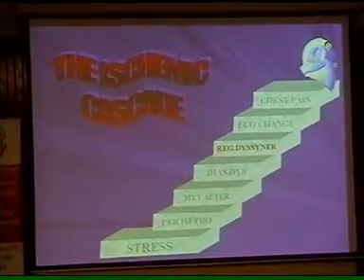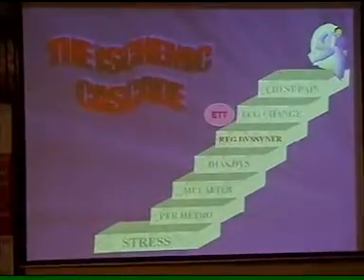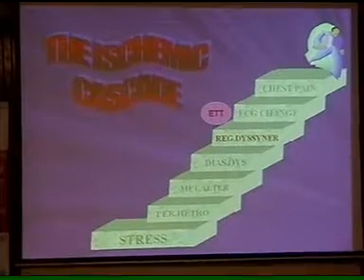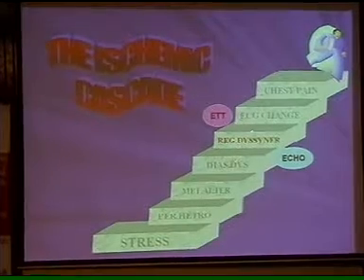And then chest pain. So the symptom of the patient comes quite late when the ischemia is already established. So what to do, and where to do, and where the things come in. ETT has a role up here when there are ECG changes. So when you subject somebody to a treadmill test to evaluate reversible ischemia, that means you are going for a low sensitivity situation, because what you are going to evaluate is his physical status as well as ECG changes. But a thing that comes quite early is echocardiography, and echo plays a role up here.